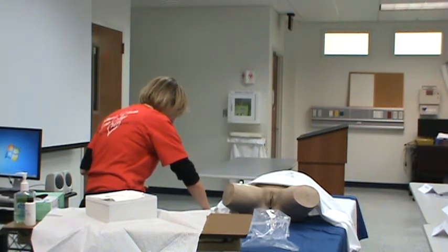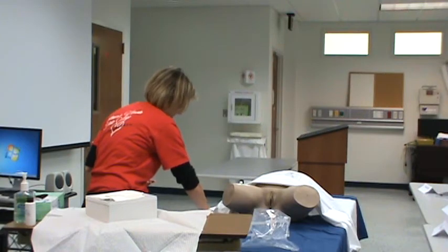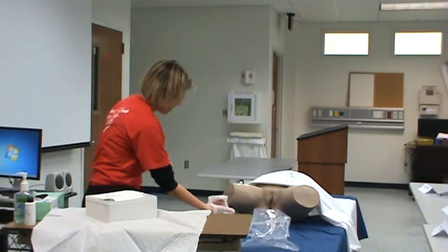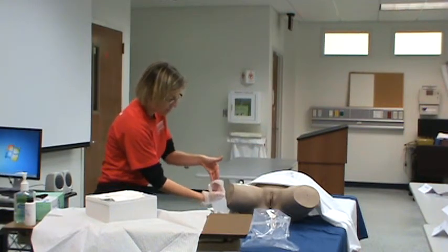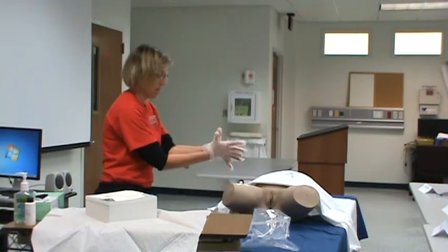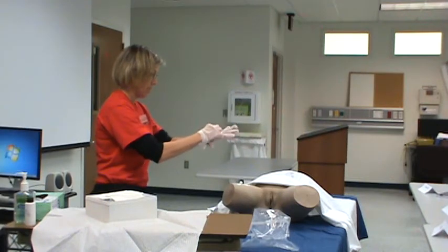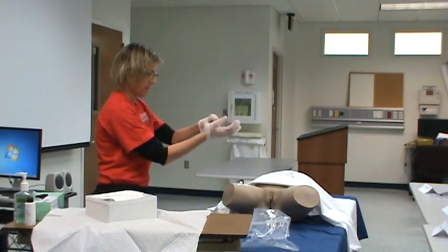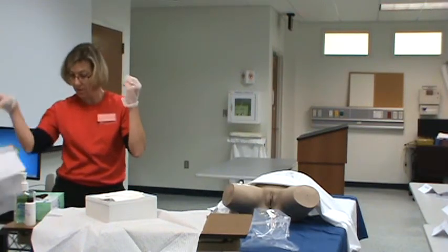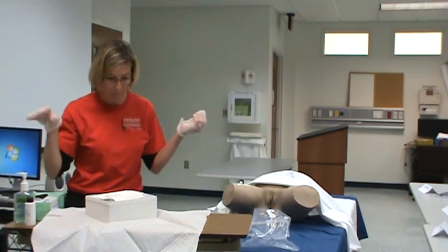We just make do, because when we go to the facilities, they're going to be the same way, okay? And then I'm going sterile to sterile. This one I have to play with a little because it's wrinkly. I tend to try to keep my thumb out so that I'm not contaminating. There we go. Now, I'm sterile to sterile, so I can take that and bring that down a little bit, but it works. It's not perfect, but it works. So again, the inside is sterile, so I can just do that. Or I could have gone like that with my elbow. That would have worked as well.